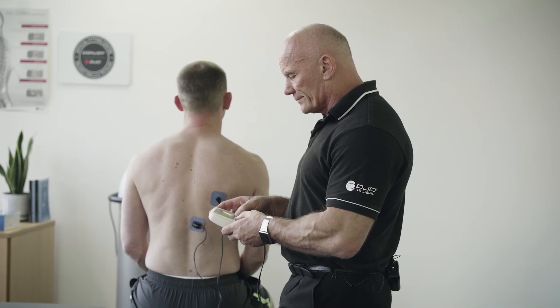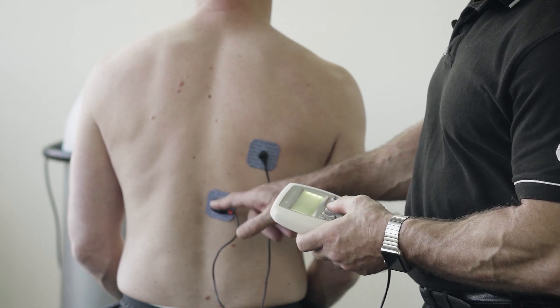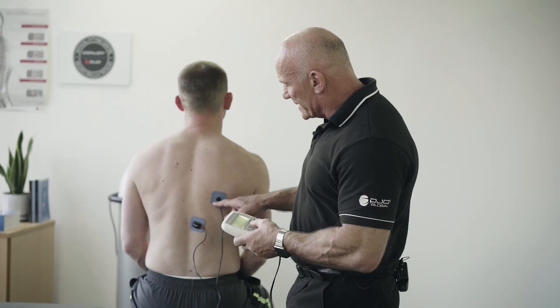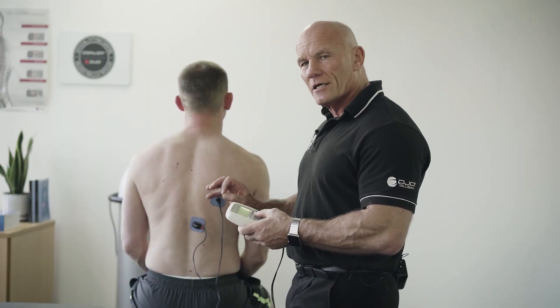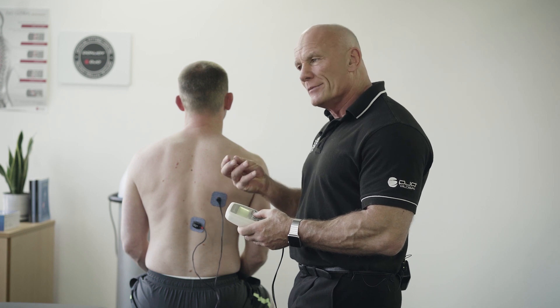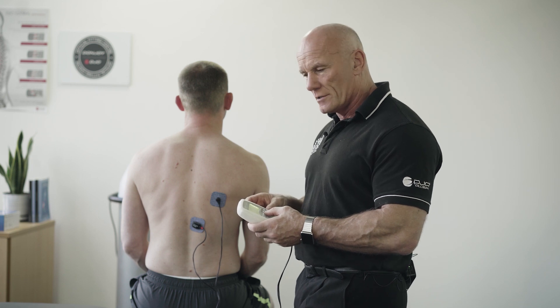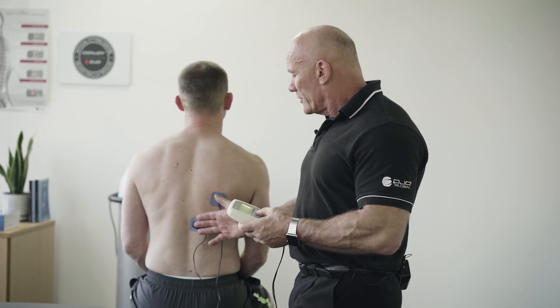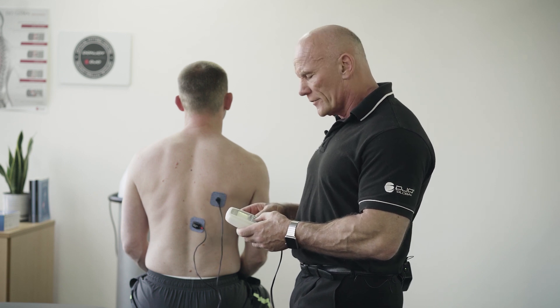I select the program, press start, and the first thing that happens is that this little sensor here is scanning the muscle to identify what is his Chronaxi. Chronaxi simply means the minimum pulse width with the minimum energy in order to get an action potential. This ensures that we not only get a safe and effective treatment but also a comfortable one for our patient.